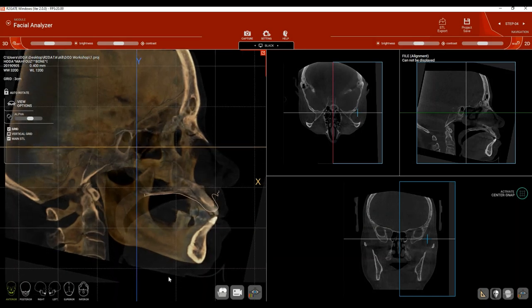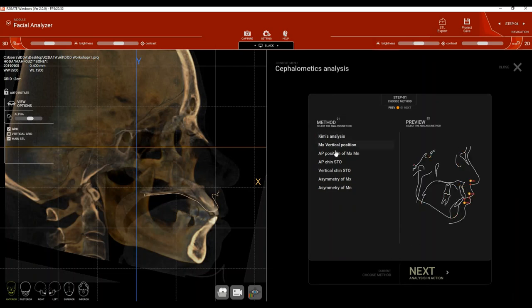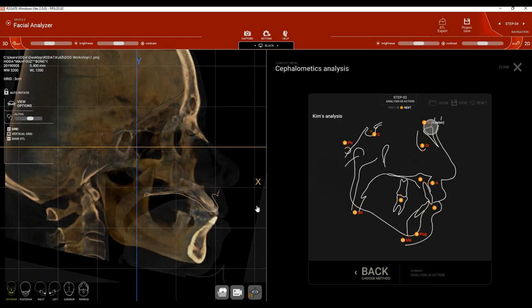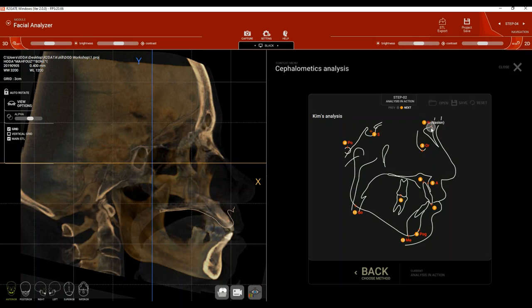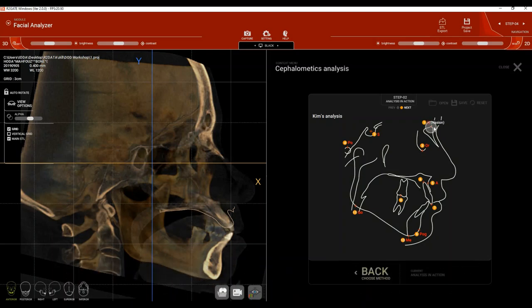In the R2Gate Digital Oral Design software there are multiple analyses available. Today we'll use Kim's Analysis, which provides information about skeletal relationship, vertical dimension, and occlusal plane angle. After choosing Kim's Analysis, click Next. The software will provide hints indicating which cephalometric points to choose. Remember that some points are placed on the 2D view and others on the 3D view.